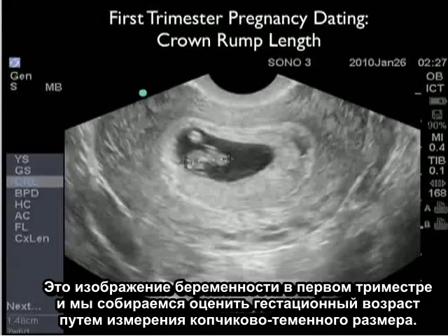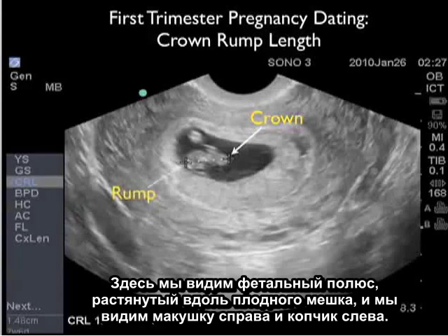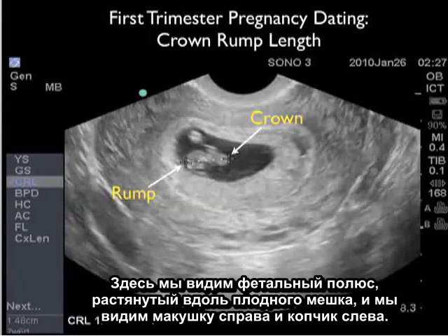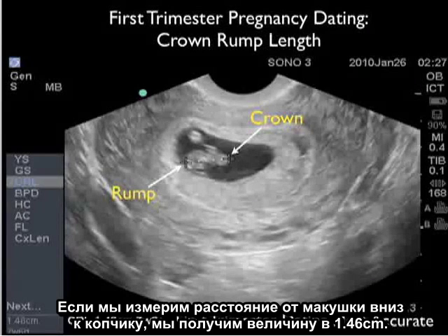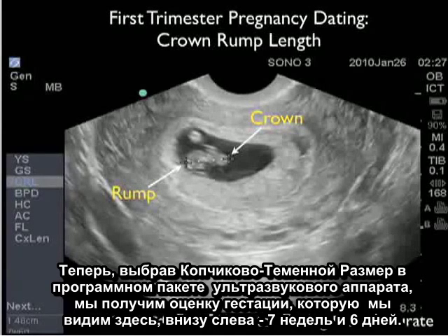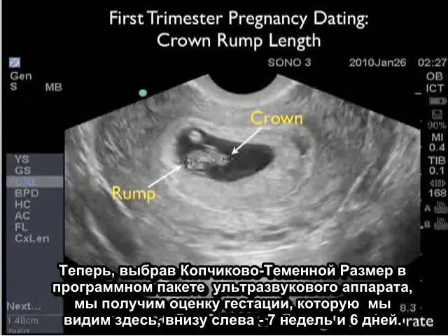This is an image of a first trimester pregnancy, and we're going to evaluate the gestational age by measuring the crown rump length. Here we see the fetal pole stretched across the gestational sac, with the crown located towards the right and the rump towards the left. Placing the calipers from crown to rump, we get a measurement of 1.46 centimeters. By selecting crown rump length in the software package on the ultrasound machine, we get an assessment of gestational age — 7 weeks and 6 days.